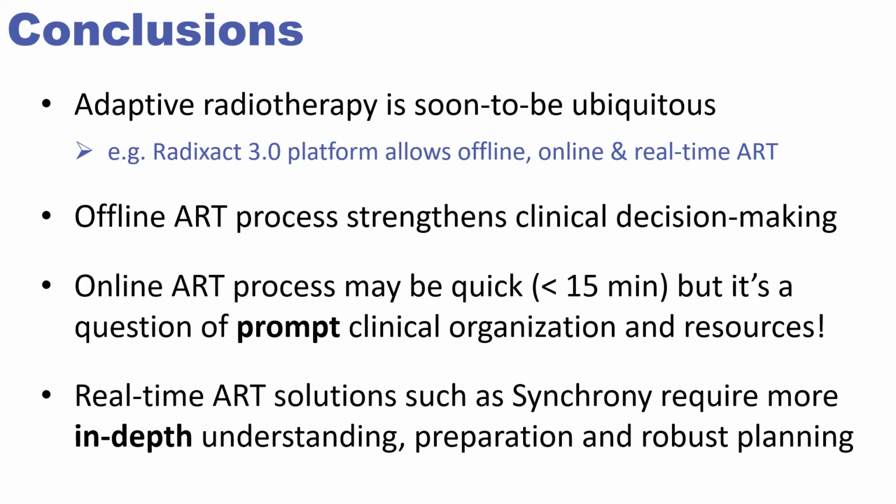I think the biggest point from my experience in the year and a half that we've had this is online: you can be quick all you want, but that's not the problem. The problem is the organization and the resources. And I think the RTT solution is fantastic. I don't know how you got that to work. It's a lot of work. Just the communication level between RTTs and doctors and us, and what we've been developing for the last year and a half. It's very hard having people on vacation who are maybe more qualified, having people substituting, and are they passing this information on? How is this information being passed on at the operating station? These are the points that really matter.